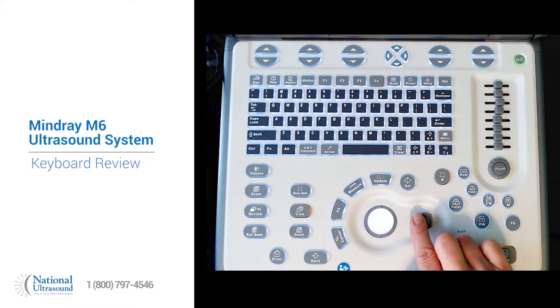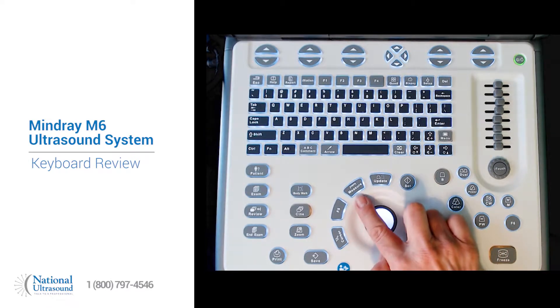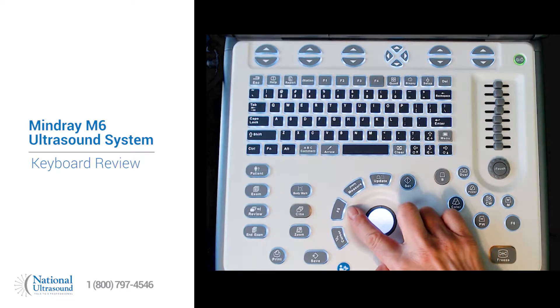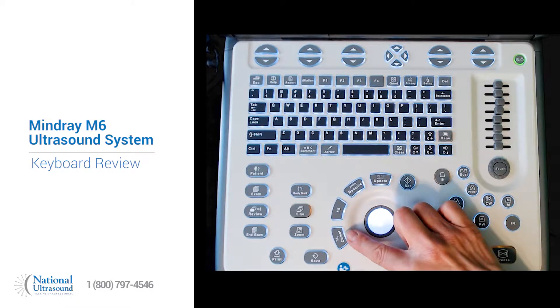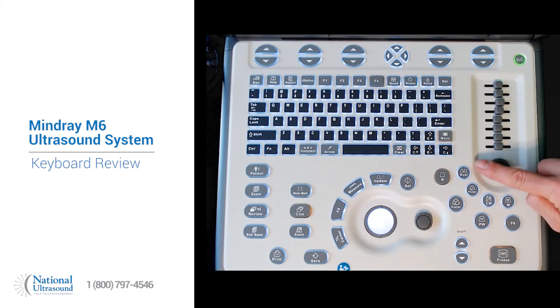Around the trackball is the enter or set button, update, measure, F5 which is programmable, a cursor button, and this is a multi-functioning button. The depth is here right beside the freeze. F6 is another programmable button. All the modes are situated here: PW, color, B, dual power, CW, and M mode.